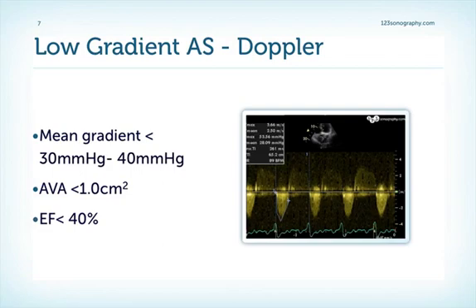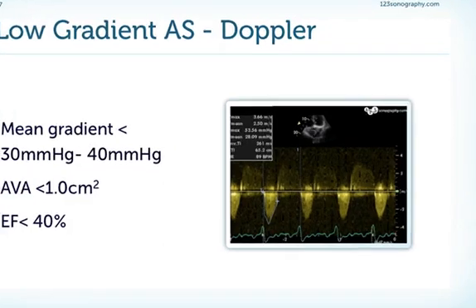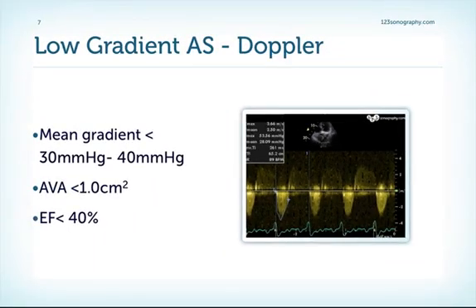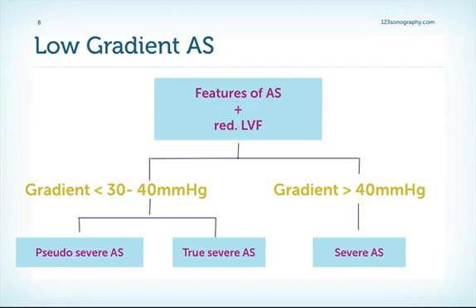We will have a mean gradient of 30 to 40 millimeters mercury with a low AV velocity. Look here on the right — the AV velocity is only 3.6 meters per second. In the calculation, we will have a valve area below one. And if we do a Simpson's ejection fraction, we will have an EF below 40%. So in low gradient, low flow aortic stenosis, we will have features of severe aortic stenosis with a valve area below one and a reduced left ventricular function.